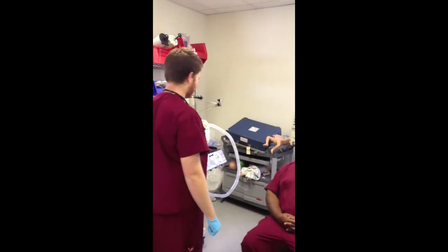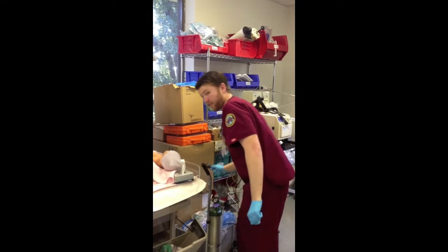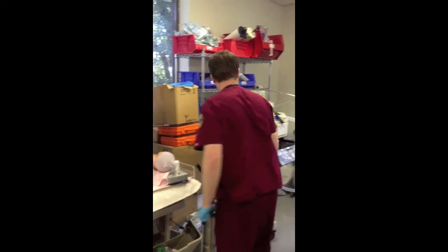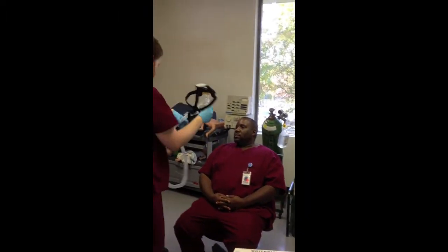Now connect the patient to the system. Adjust the BiPAP mask and headgear, set the ordered pressure levels, and verify that the system is working properly and that the patient's ventilatory needs are being met.